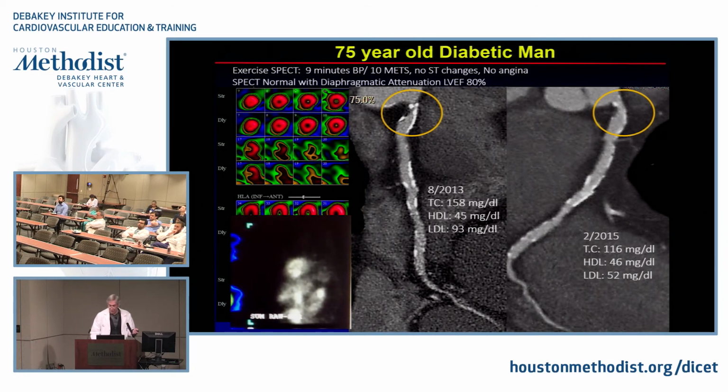Okay. Was there any progression anywhere else? I'm sorry? Was there progression? No, he had no progression at all. Okay, so everything. Everything, yeah. But this significantly went down.